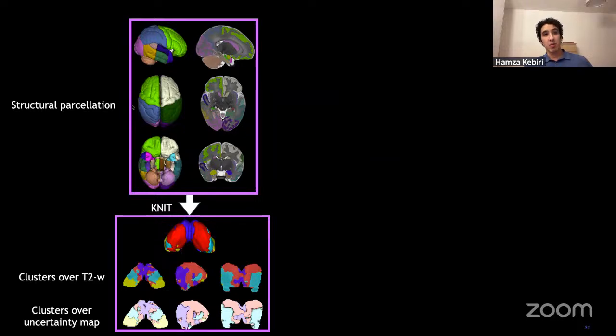These are the different brain regions that are considered here, and this is an example of a 42 weeks subject. First of all, all this clustering is done voxel-wise, but still we could get something symmetrical across the two hemispheres. We could also get some physical proximity: the voxels that are nearby are usually assigned to the same cluster, which is a good start at least.